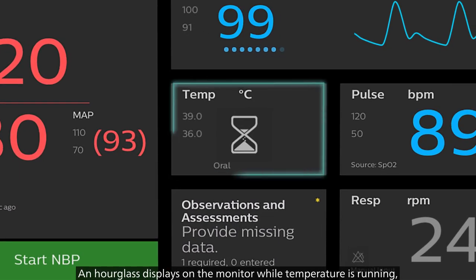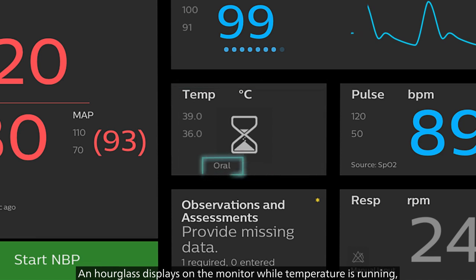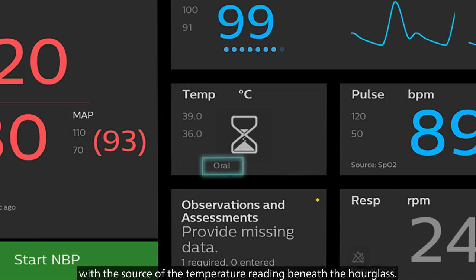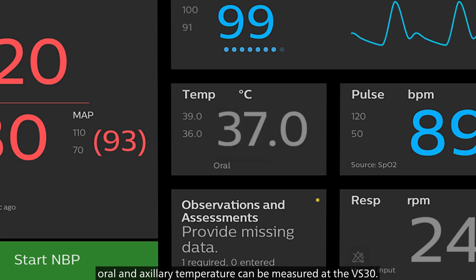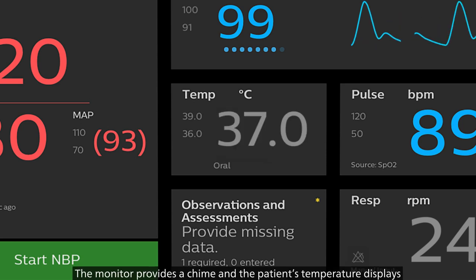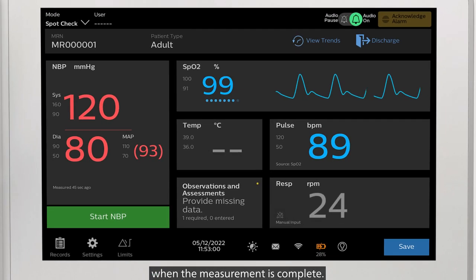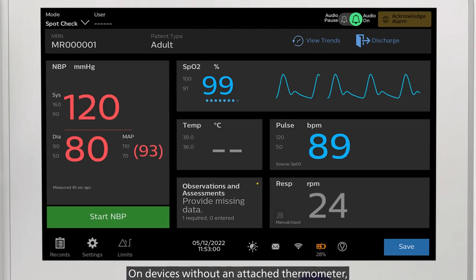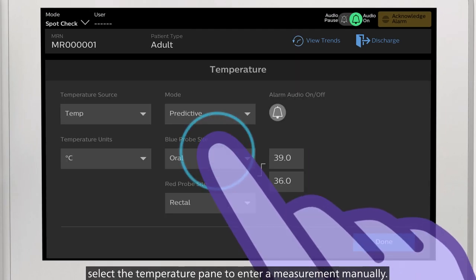An hourglass displays on the monitor while temperature is running, with the source of the temperature reading beneath the hourglass. Oral and Axillary temperature can be measured at the VS-30. The monitor provides a chime and the patient's temperature displays when the measurement is complete. On devices without an attached thermometer, select the temperature pane to enter a measurement manually.